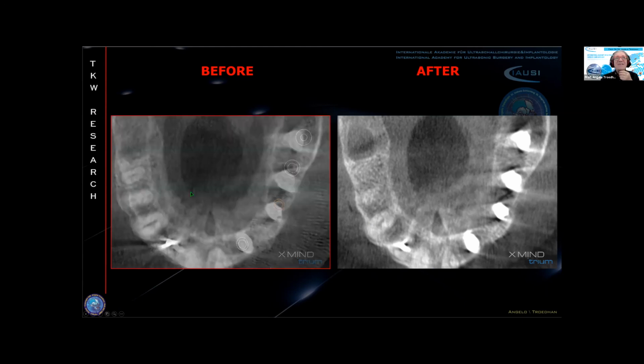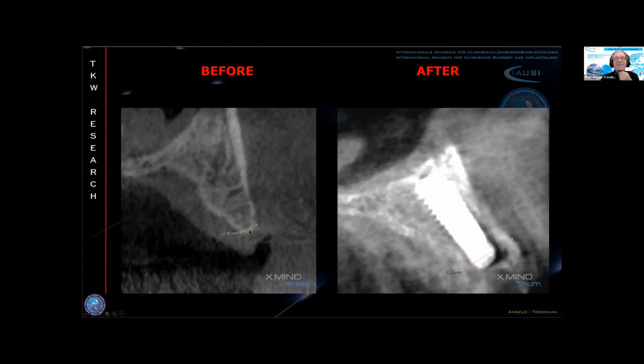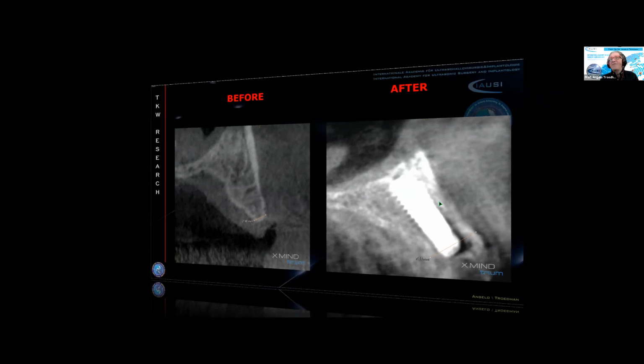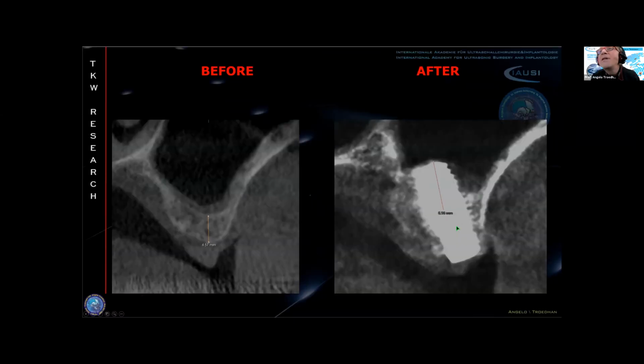And here you can see before 2.96 millimeters on the same side. Now we have 7.4 millimeters. Here, 4.5 millimeters. And we achieved an additional 6, let's say 7 millimeters to do a rounding, because it's always funny to have 0.01 millimeter measurements.